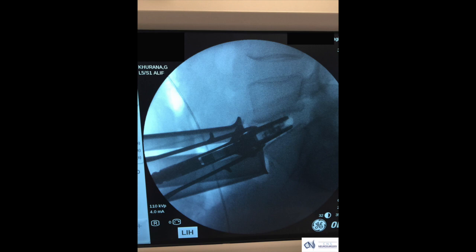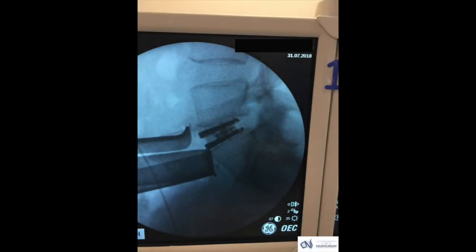Here you can see the disc being placed almost at its final resting position, and here it is at its resting position. Now the disc space is a beautiful large disc space filled by a mobile artificial disc prosthesis.